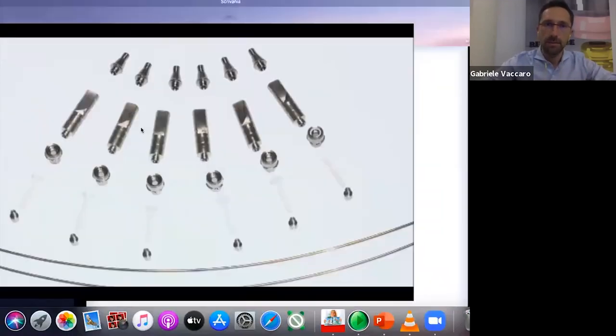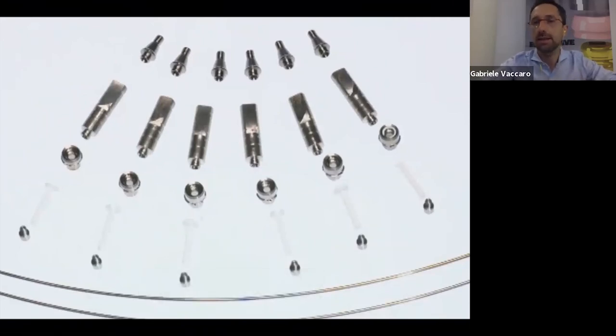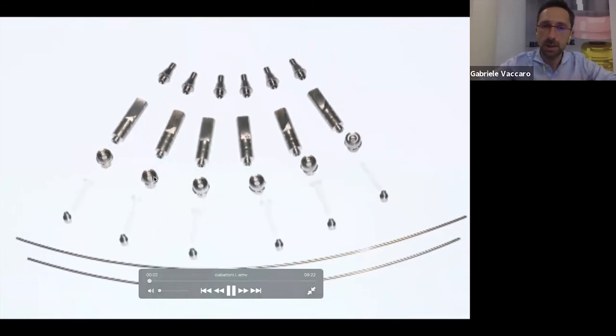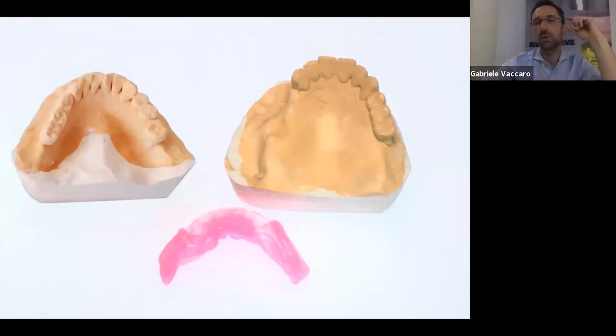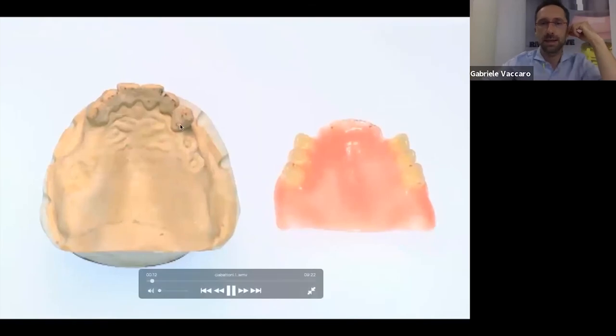Okay. Now, let's see a more complex case, because we now have the opportunity to use this system to build up an immediate load full arch prosthesis, a temporary prosthesis. So what we need is a special abutment with two holes for the wire connecting together. So let's have a look step by step at what we are doing.